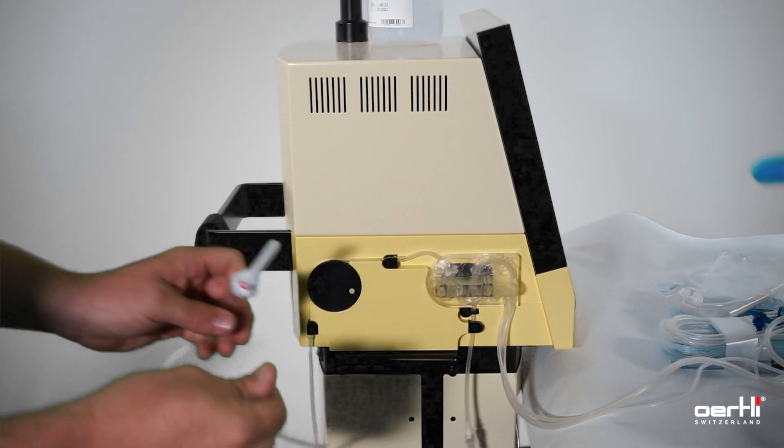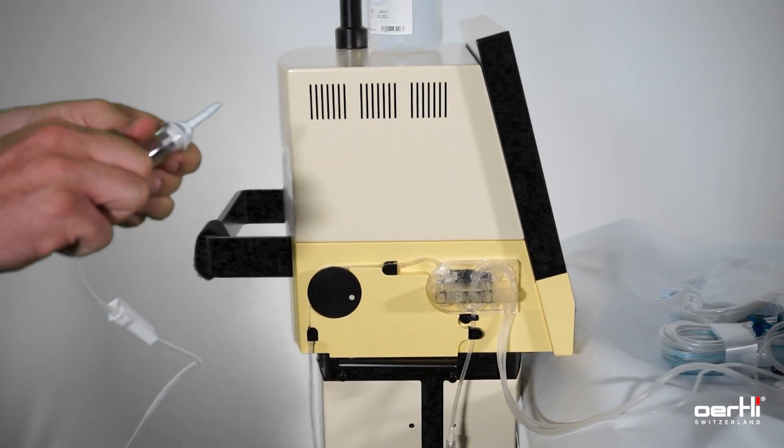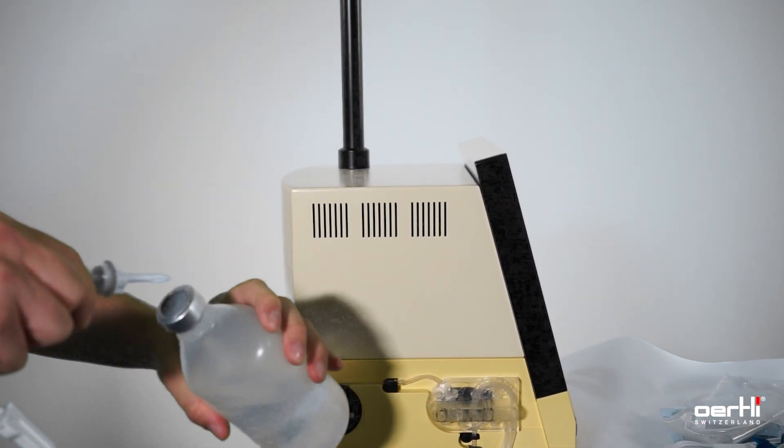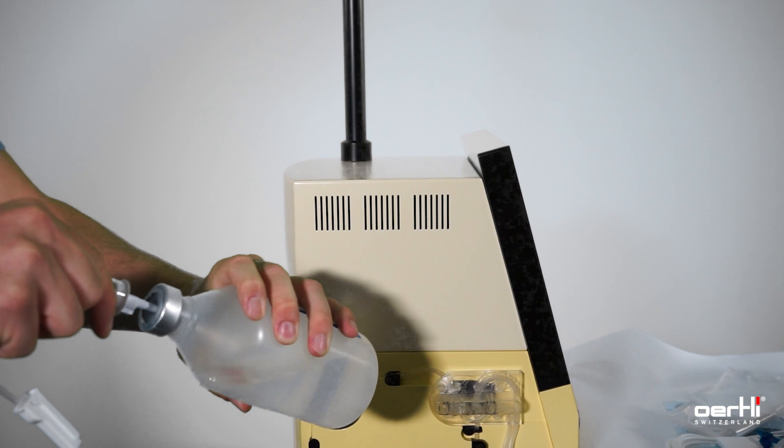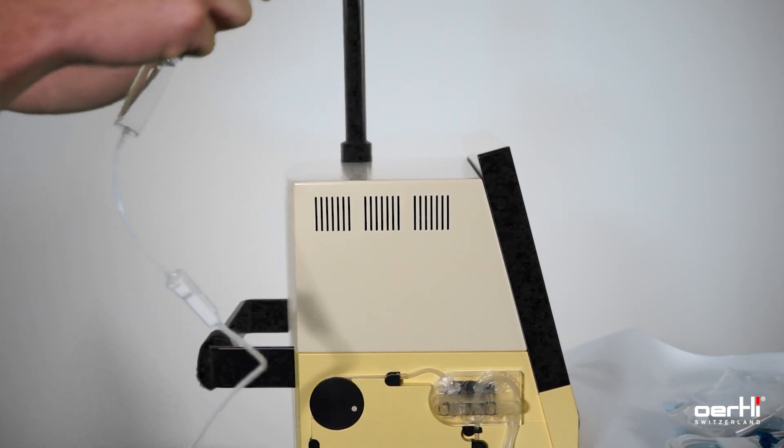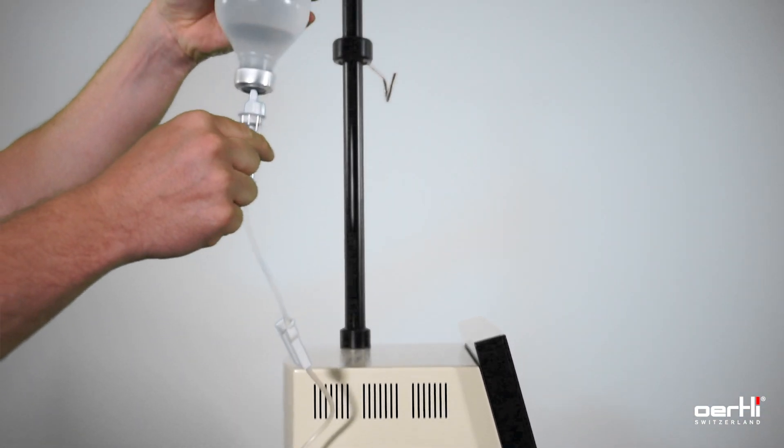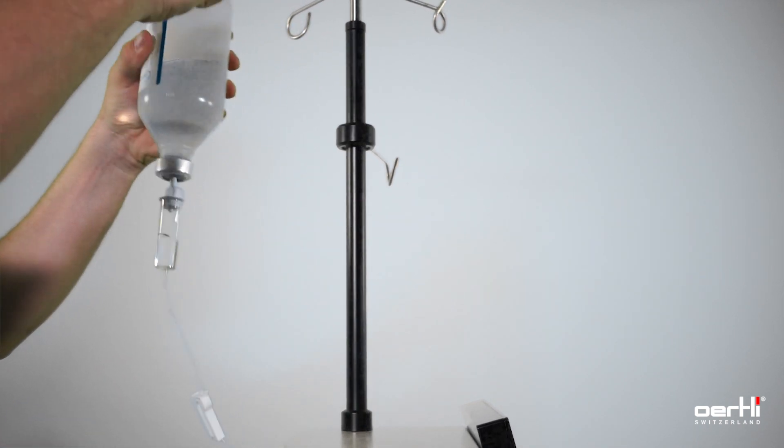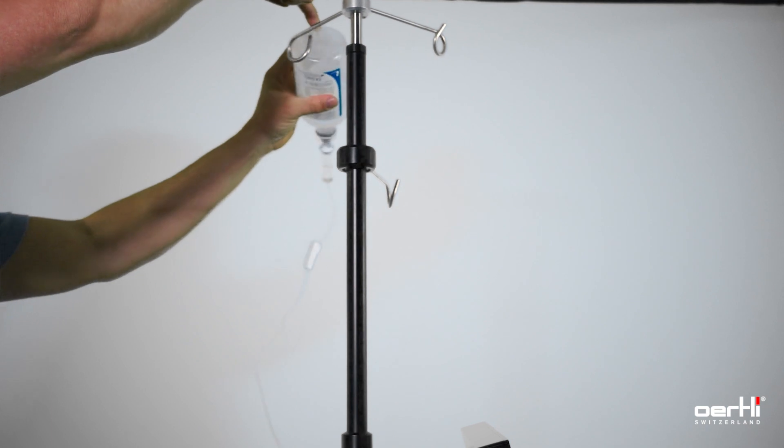Remove the cover on the drop chamber and put the drop chamber into the BSS bottle by holding the valve downwards. Fill the drop chamber approximately 50% and hang the bottle to the IV pole.